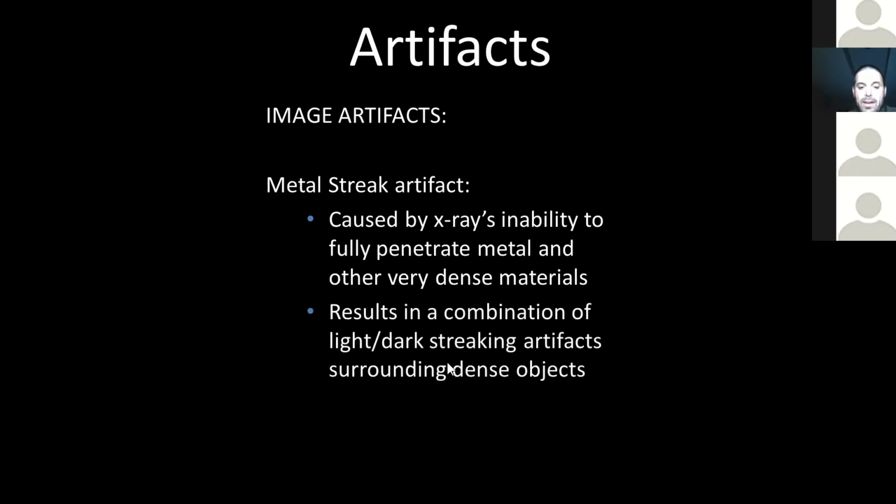Okay, so I'm going to spare you the physics. We could talk all night about what's actually happening there. We won't. But what you get at the end is this combination of light and dark streaking artifacts that surround these very dense objects. So let's look at a picture.